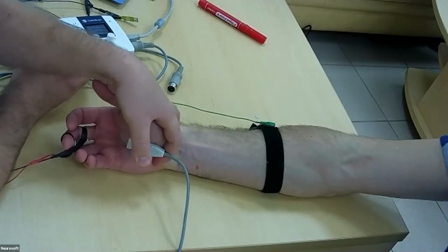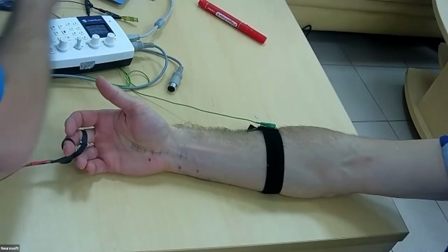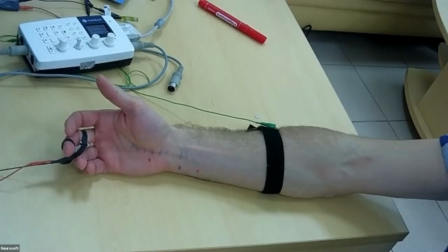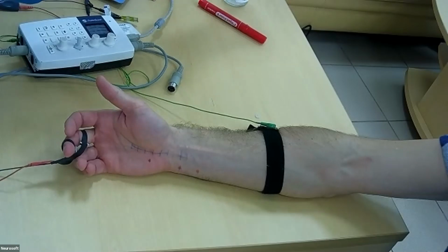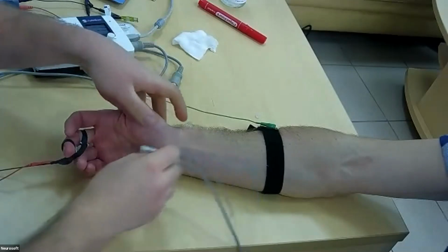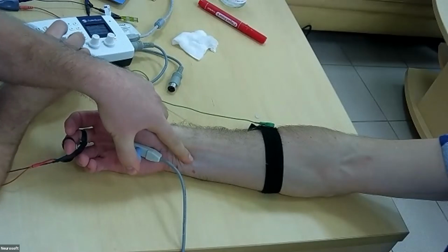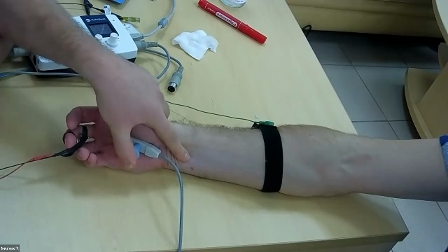We need to get a good answer. It's a little bit water the stimulation electrode. Evgeny, screen demonstration is not activated. Oh, I'm sorry.